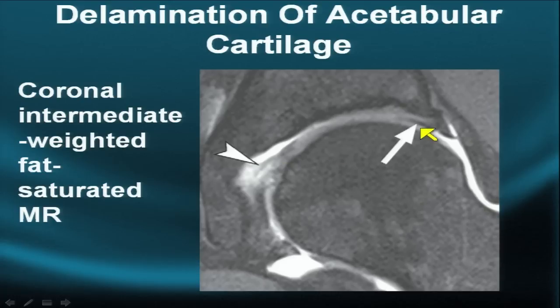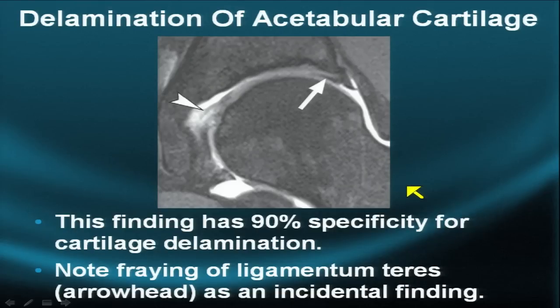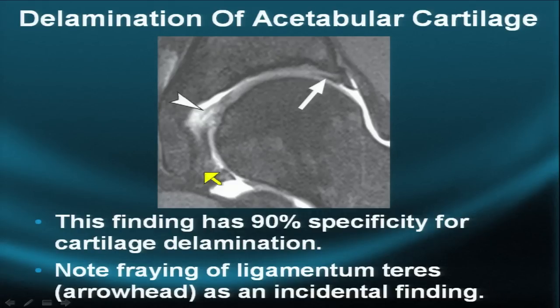This laminar effect of dark signal intensity in the superolateral acetabulum is diagnostic of chondromalacia. It has 90% specificity for cartilage delamination or cartilage peeling. The ligamentum teres insertion and its fraying are highlighted, remembering there are two bundles of insertion: a pubic and an ischial bundle.